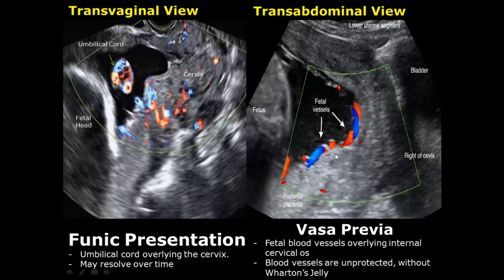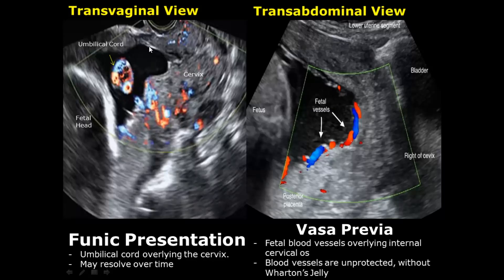A vasa previa occurs when there are fetal vessels overlying the internal cervical os. These blood vessels are also not protected by Wharton's jelly. It is different from a funic presentation, in which the umbilical cord overlies the cervix — here we can see the umbilical cord moving and floating in the amniotic fluid, and we can also see the Wharton's jelly.